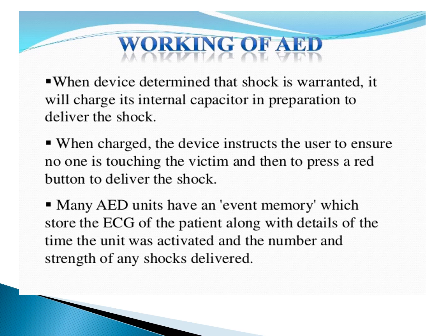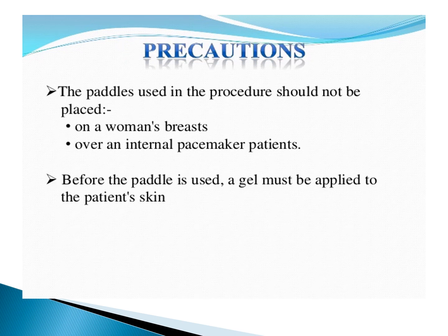Many AED units have an event memory, which stores the ECG of the patient along with the time the unit was activated and the number and strength of the shocks delivered. Now the precautions. The paddles used in the procedure should not be placed on the woman's breast, and if the patient has an internal pacemaker, we can't use the pads over that. Before the paddle is used, a gel must be applied, because if you do not apply the gel, it will cause burns to the skin.